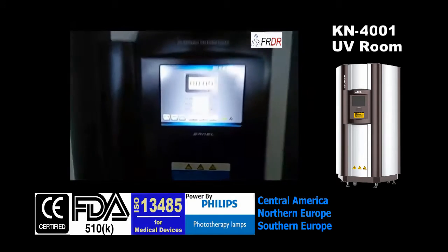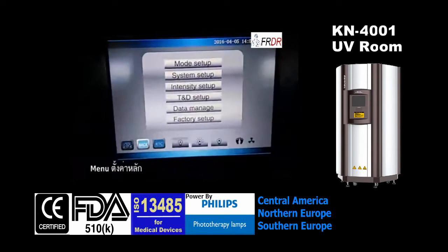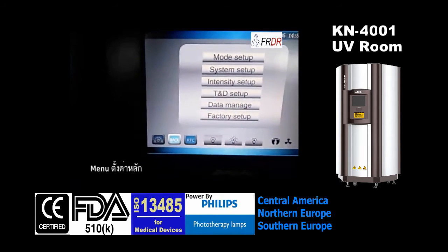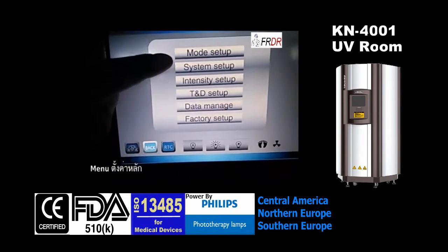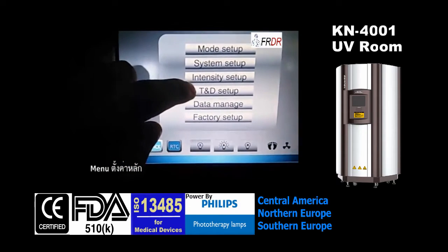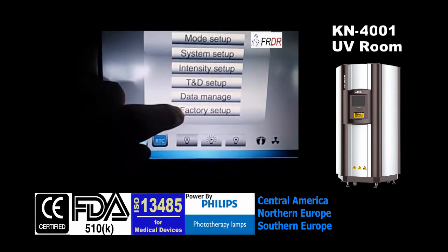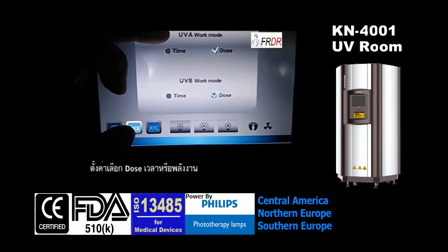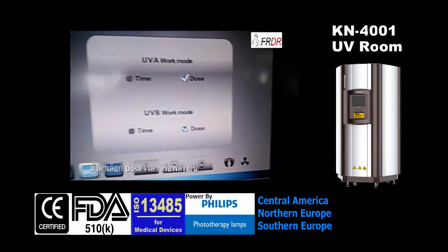There is a touch screen — now I'll show you how to operate this software. This is the touch screen, and here we have model setup, system setup, intensity, time and date setup, and data management. This is factory setup.